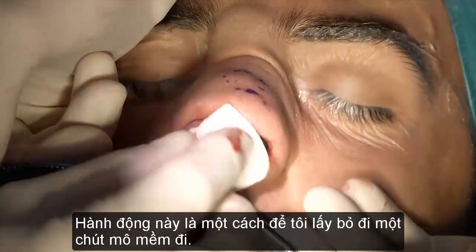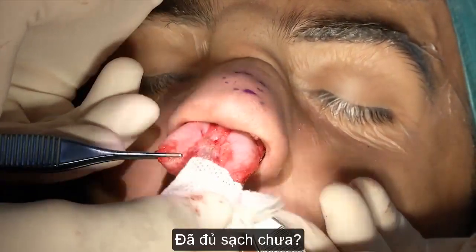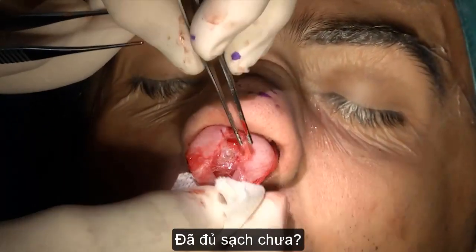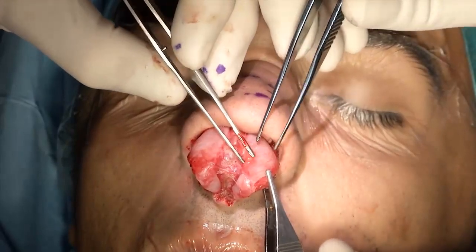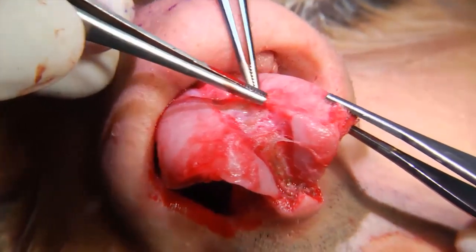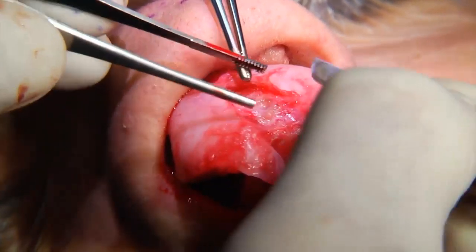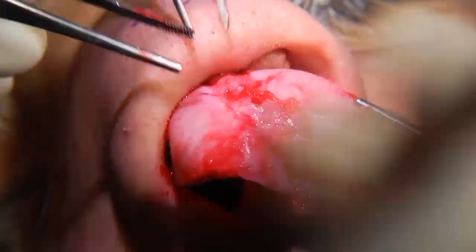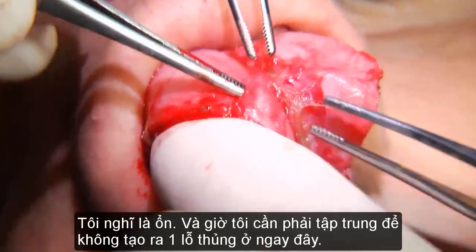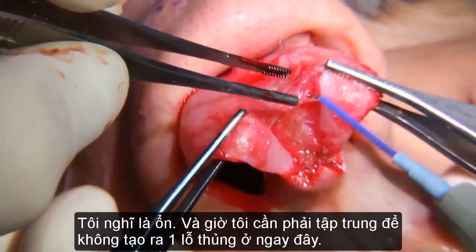So this maneuver is the one by which I take some of the soft tissue. Now, are these clean enough? Essentially, yes. Now you need to pay attention not to make a hole here.